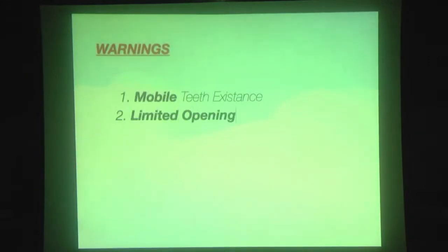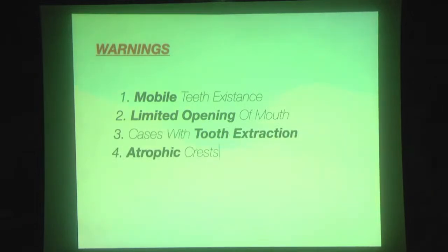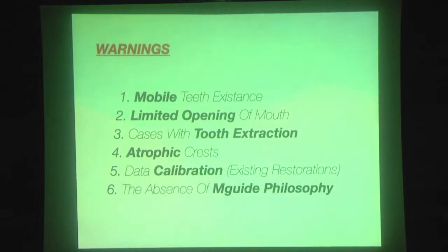Yeah, I have some warnings, and it is very important. The most important thing, if you had a mobile tooth in the mouth, it is almost impossible to create a guide. Why? Because you cannot take the impression. If you do a physical impression, think. You get the volume in the spoon and get the impression, and the mobile tooth moves.